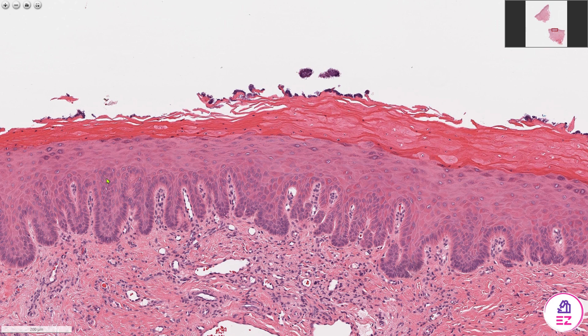I'm delineating now where we have quite proliferative bulbous rete pegs. If you look at this one in particular, you can see it's wider at its base than towards the neck, and this one here is quite wide or drop-shaped. There's also a degree of budding, which is quite a worrisome architectural feature. This rete peg pattern is concerning for dysplasia because of this bulbosity and budding architecture — these are architectural features of dysplasia.